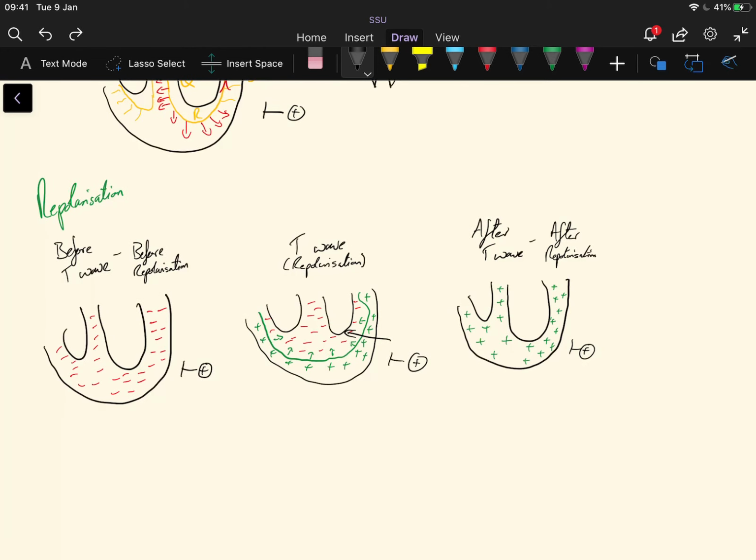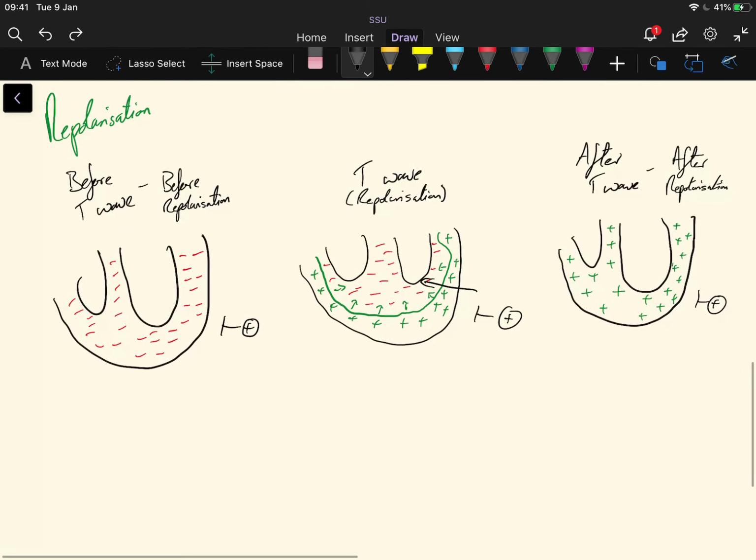So that's why our T wave is a positive deflection normally. Okay, so we have our P wave, QRS, and then a positive deflection, because the overall charge is moving away from the heart. Okay, moving away from the lead, I should say.